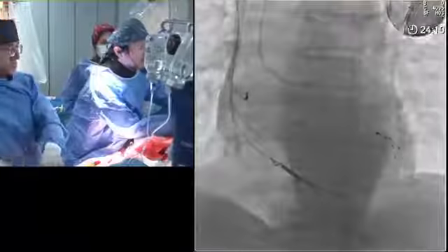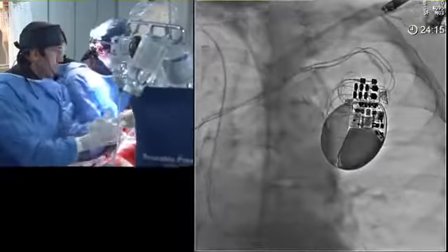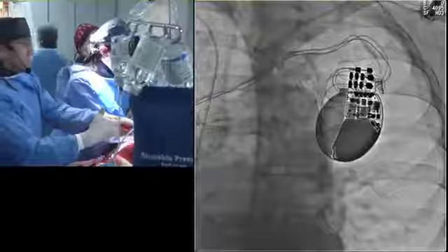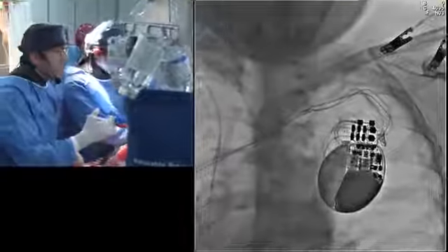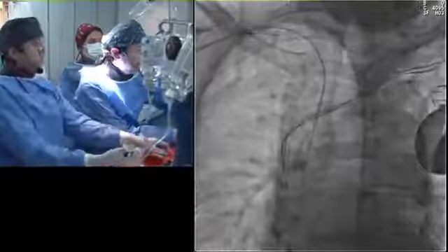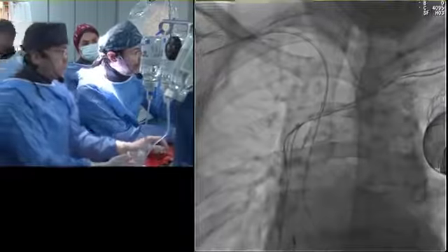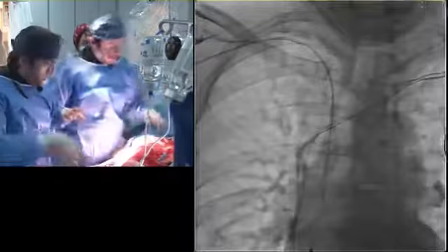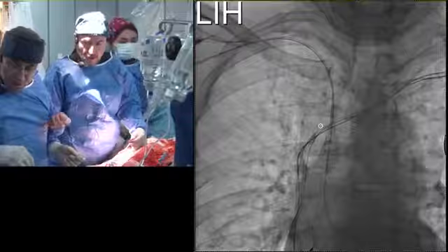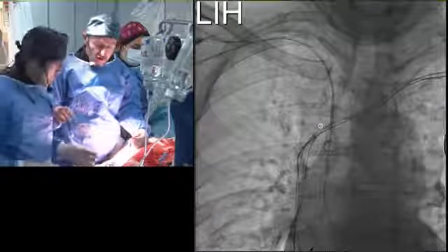Hadi göster yukarı, gençler yukarı gösterin bana. Tamam. Hadi göster yukarı, subklavyene döneceğim. Tamam, ver şimdi bana snare'i. So I think we have also some kind of an S aorta here that makes it very difficult to go into that narrow space, but I will try my best to narrow the space as much as possible. So let's see. Alabilir miyiz?